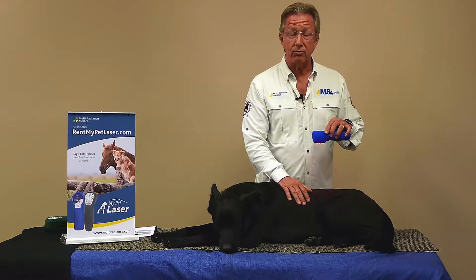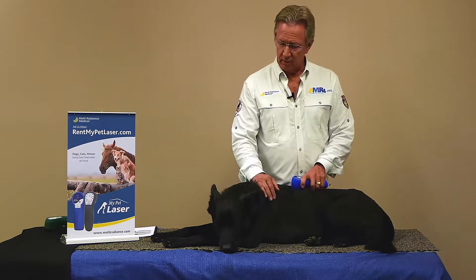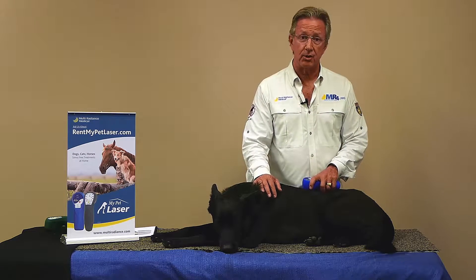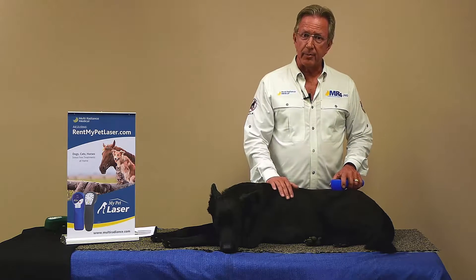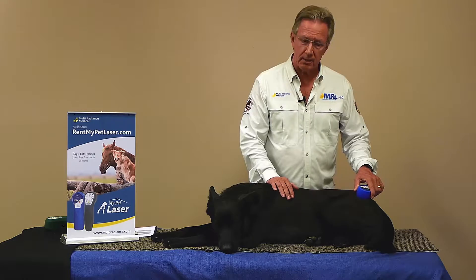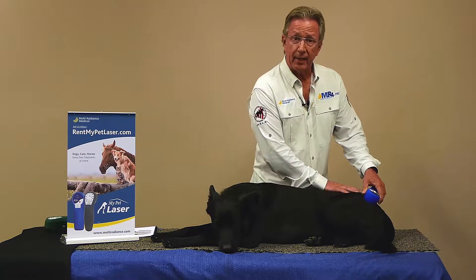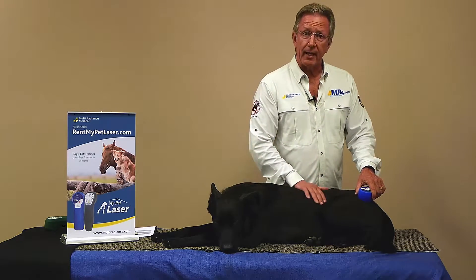Some dogs, cats and horses don't like needles. So now we have something that's very comfortable, very easy for them to tolerate, and we get this wonderful endorphin response which just makes them really nice and chill and relaxed. You're now part of the therapy team, part of this healing process — using the power of photons to reach into these tissues deeply and get the job done to relieve pain, relieve inflammation, or provide extra fast healing.